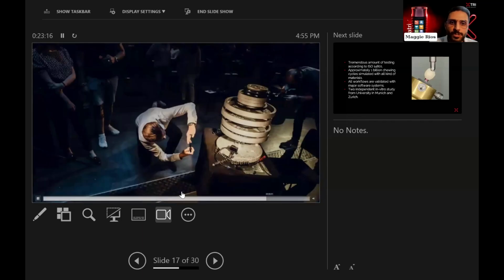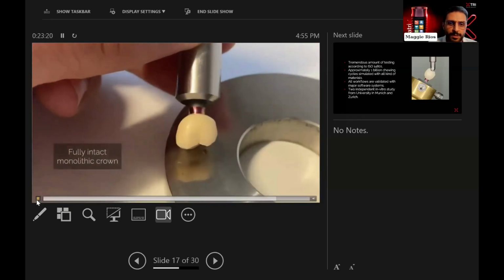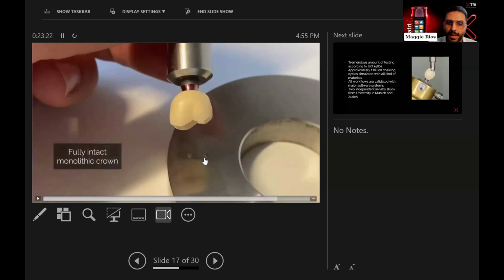Another thing that it shows here, and I want to show it to you, which is really interesting: you can see the marking on that little metal bit, which was in between the weights and the implant. You can see the marking that the zirconia created because of all the weight on top of it, but nothing happened to the implant or to the screw.